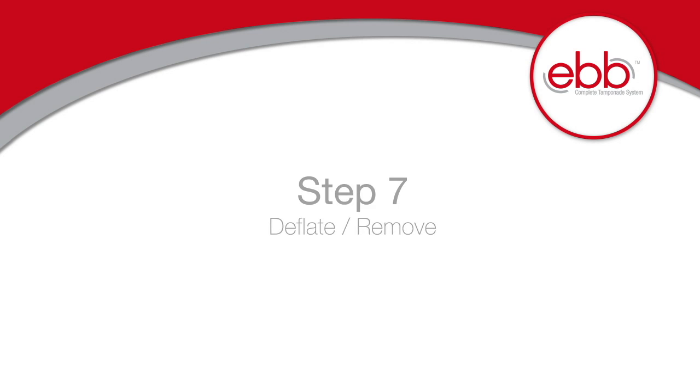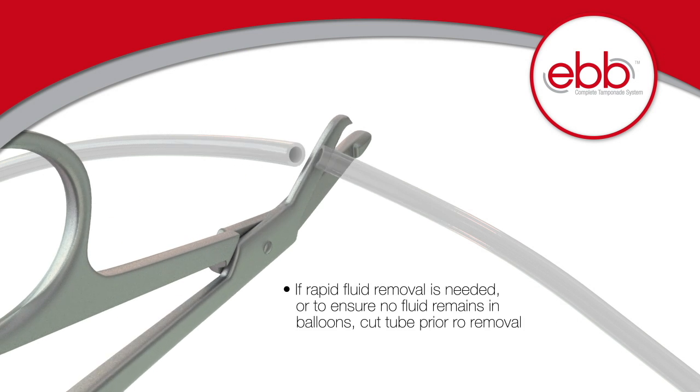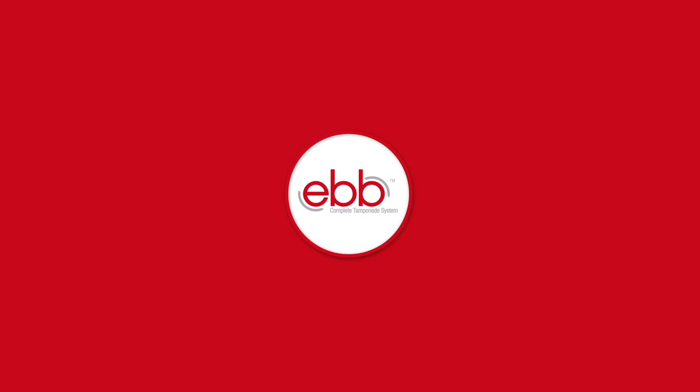Step 7: Deflate and remove. Once tamponade is achieved and the patient is stabilized, open the stopcocks to remove fluids slowly, or titrate using a syringe according to your hospital's protocol. If rapid removal is needed, or to ensure no fluid remains in the balloons, you may cut the tubes prior to removal. Ebb Complete Tamponade System by Clinical Innovations.